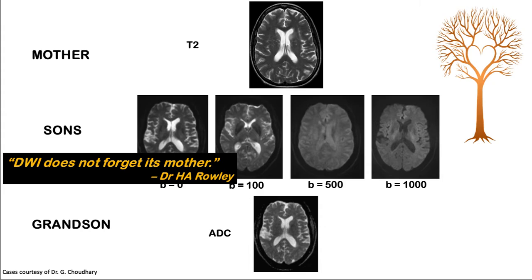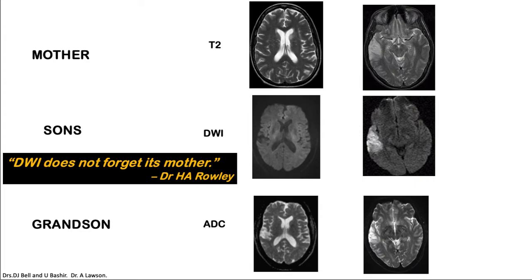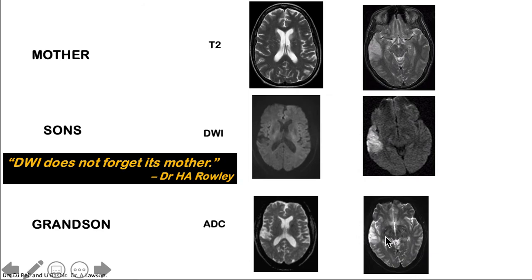Another concept is that the DWI does not forget about its mother. It means that if there is high T2 signal on T2, that signal will spill over or reflect within the DWI sequence. For example, this area in the right temporal lobe has a T2 hyperintense signal as well as a DWI hyperintense signal, but when we check the ADC map, there is no corresponding drop. Therefore, this is what we call T2 shine-through.